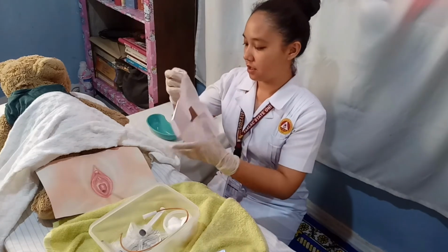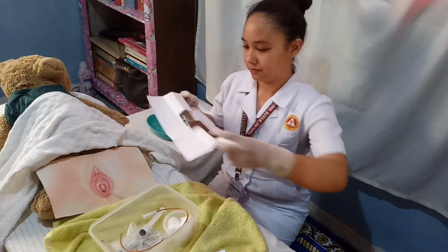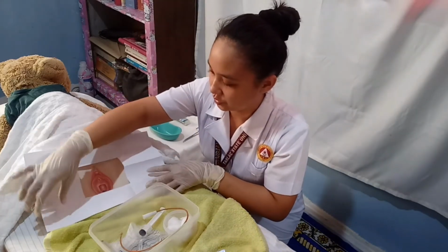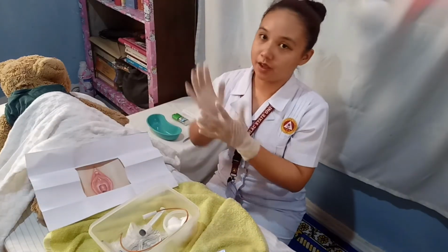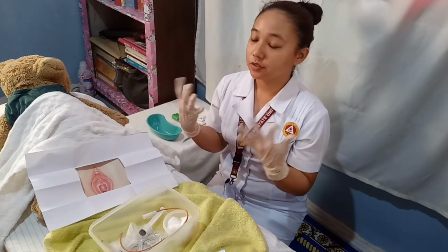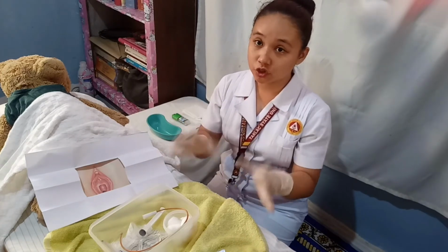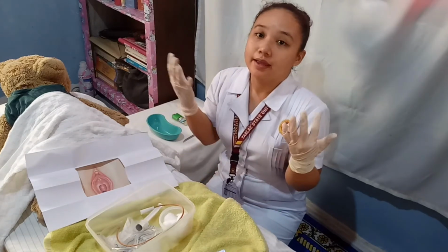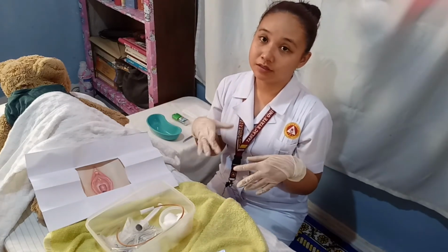So let's have this one here. And then now we need to place the sterile tray drape between the patient's legs. So here. And then now we need to open all the supplies.